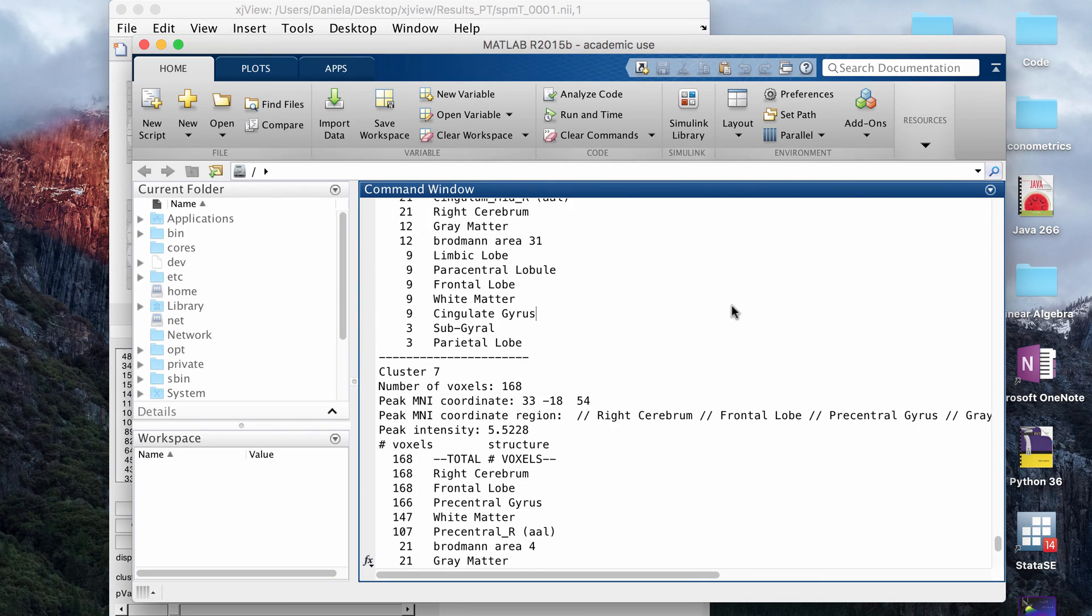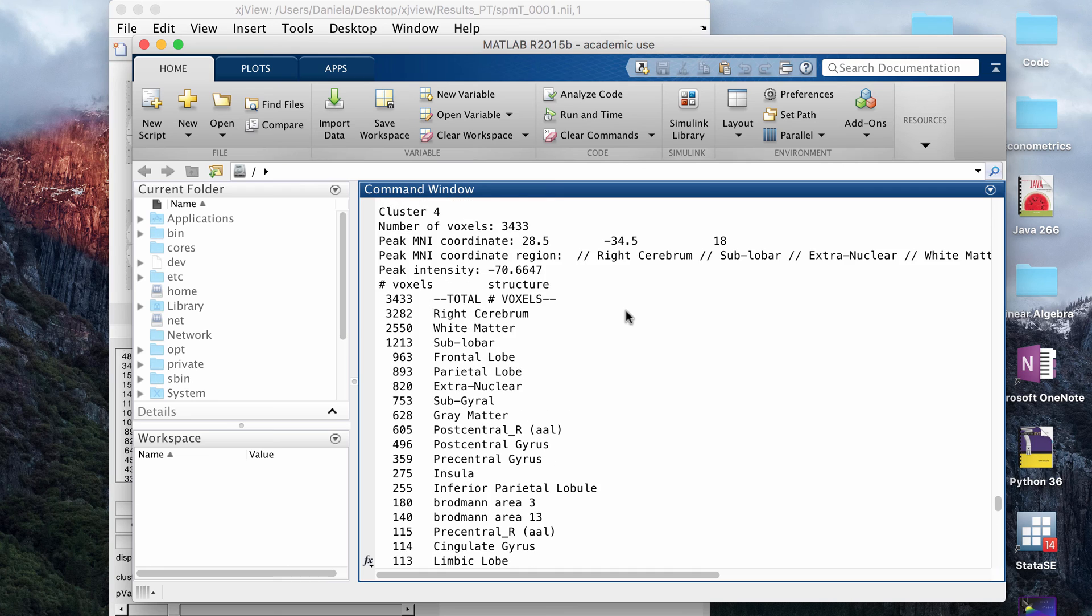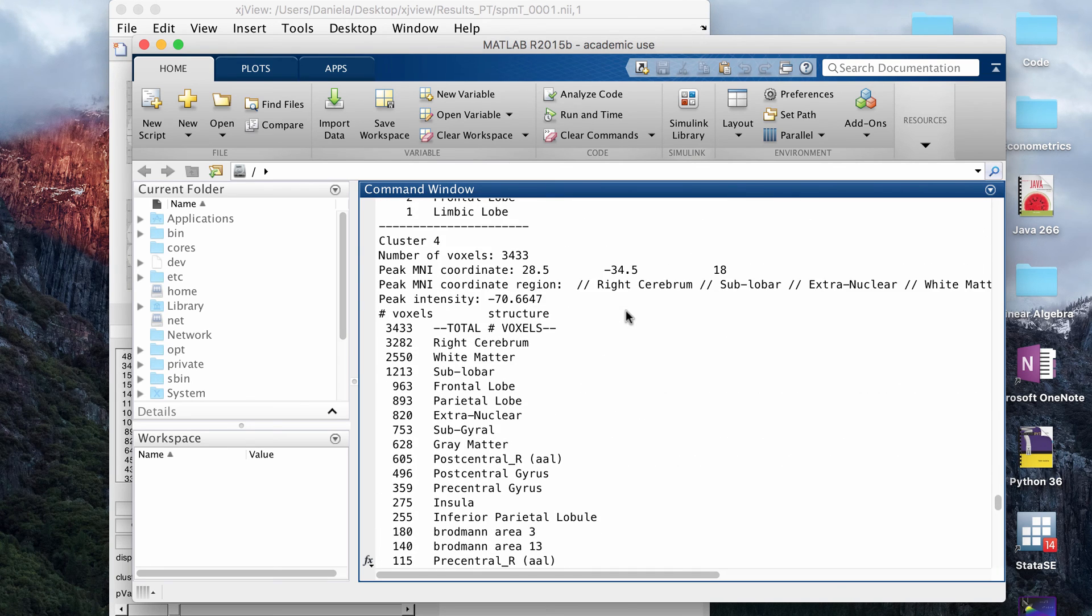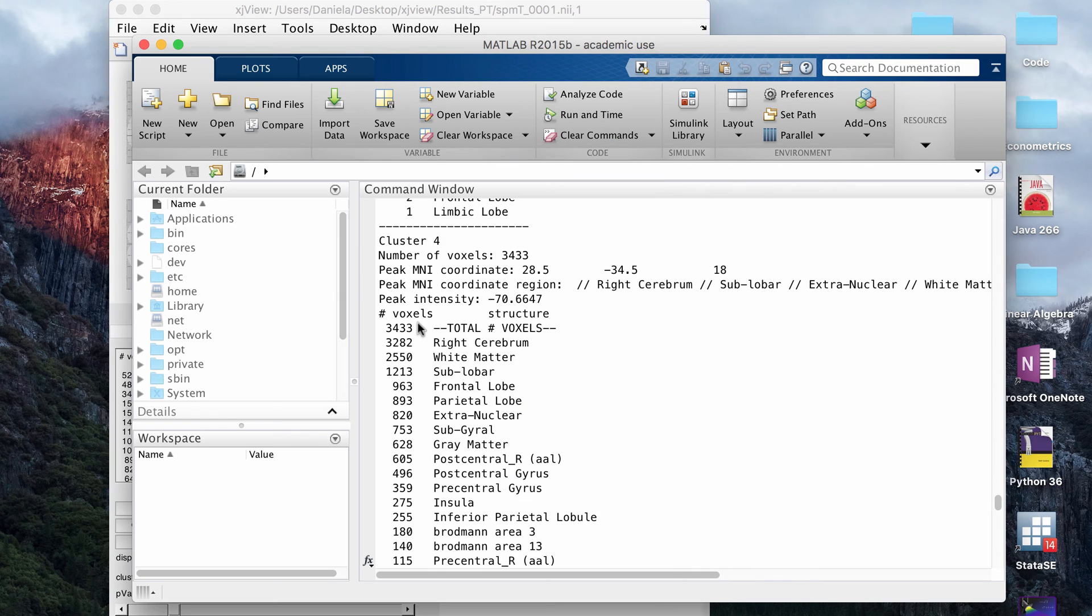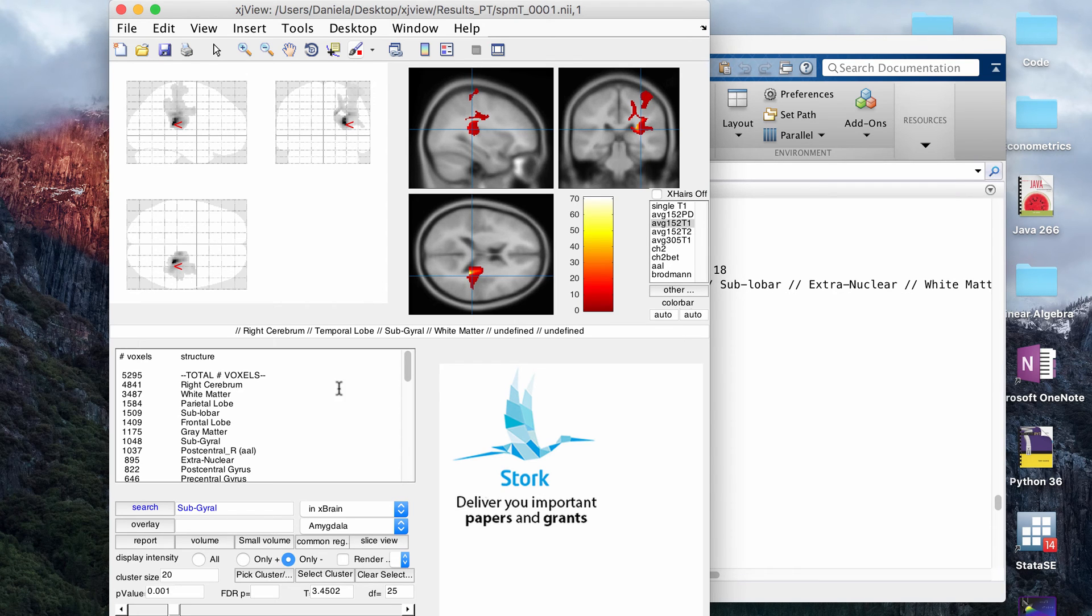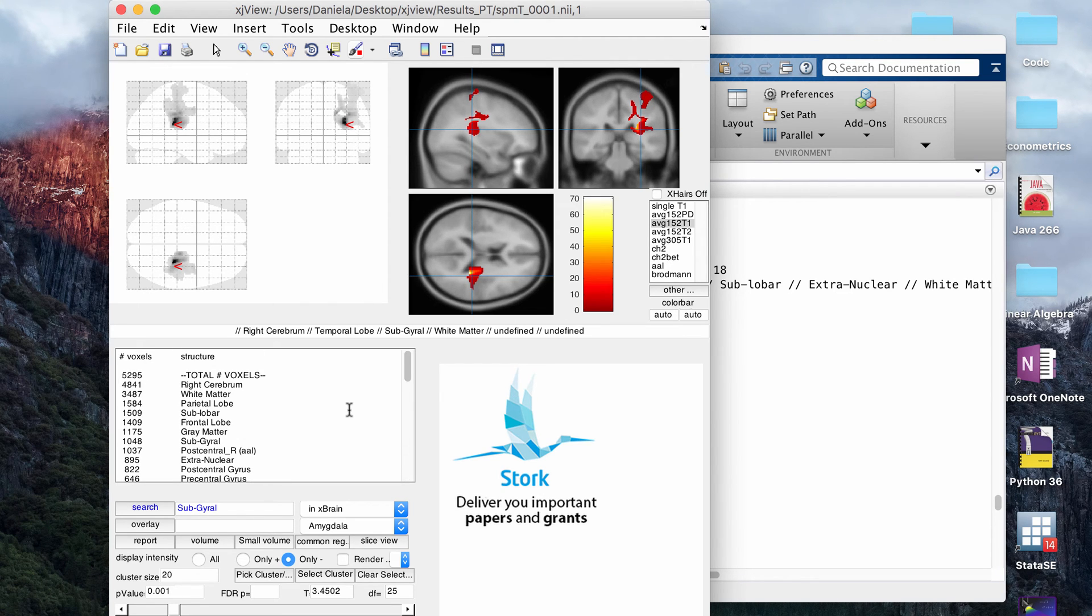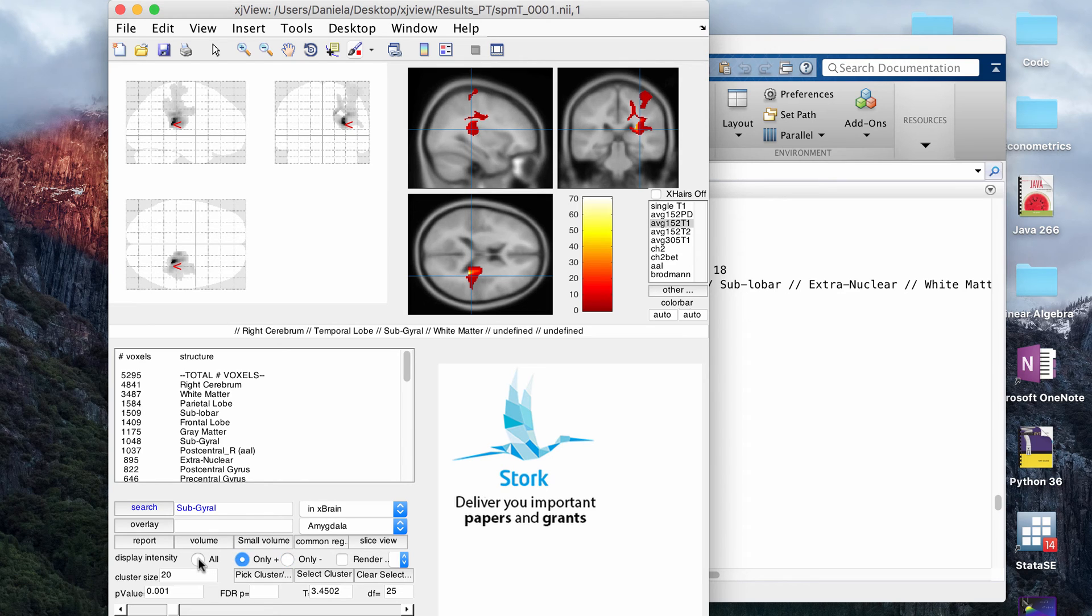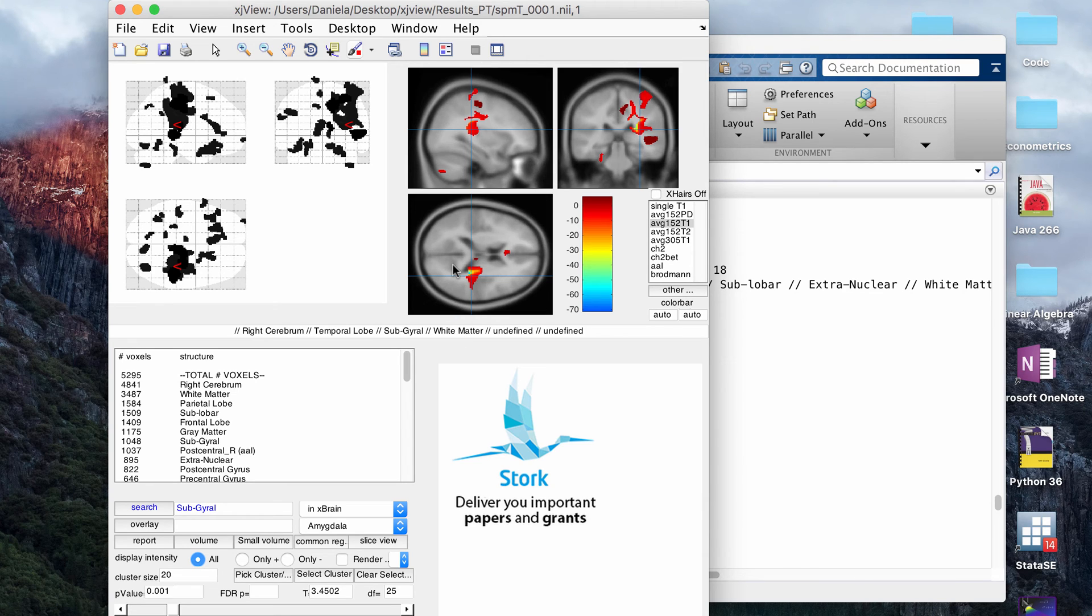If I go here, we have eight clusters, and we can find... I think I changed the statistics, but you can basically find which cluster is matching up to the statistics here. I think I was playing around with it, so that's why the numbers are a little bit different, but this cluster 4 is probably the cluster I'm picking here now. So you can match it up that way and see where the report is picking up the clusters on the map, and after you click this, if you want to undo it, what I do is usually I'll just click the radio buttons, and if you just click positive or negative and then click all, it will show you again the clusters, because they don't really have an undo button, so you just have to kind of click around to undo it, and now it's showing the same number of all the clusters again.